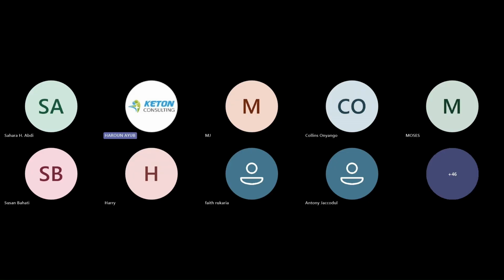So for RDTs, it's clearly defined because you might have that particular intermediate area. So you need to check where you are falling, or for an automated analyzer, check what the cutoff of the manufacturer is saying. If the machine is not giving you the interpretation, sometimes remember the machine can give you an interpretation. We are doing quantitative for HIV and you get a value. So that particular value, if the analyzer is not interpreting for you as positive or negative, and it's for you to interpret, you need to focus on the cutoff, because cutoff will vary between instrument and vary between reagents.